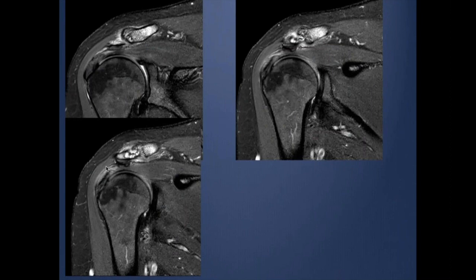Here you can see severe degenerative changes at the acromioclavicular joint with significant edema. If you look carefully, there is thickening of the undersurface of the acromion, which is indenting and deforming the bursal surface of the supraspinatus. This is a little bit away from the joint — this is what we call the subacromial spur.